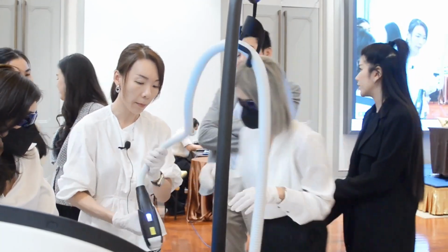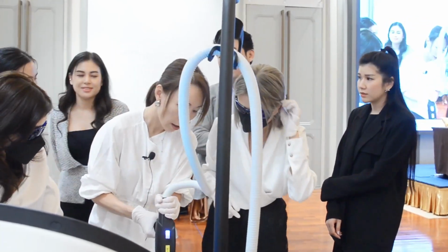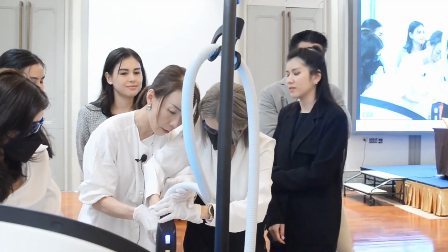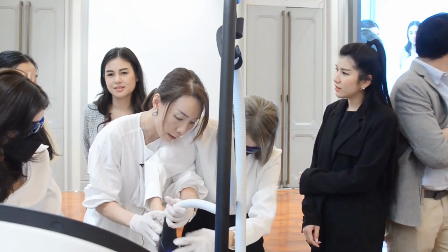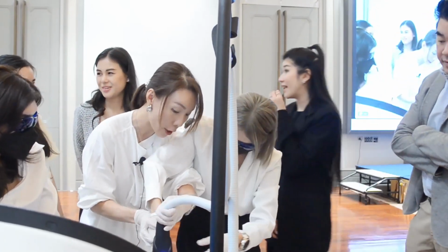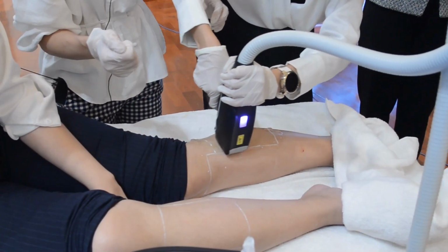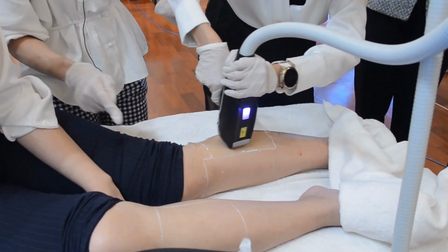Okay. So what you need to do is you put your hand here first. Don't press the button yet. Okay. So what we do is don't press the button. Just hold first. 2 hands. Okay. Start moving the handpiece. Yes, and then come down.